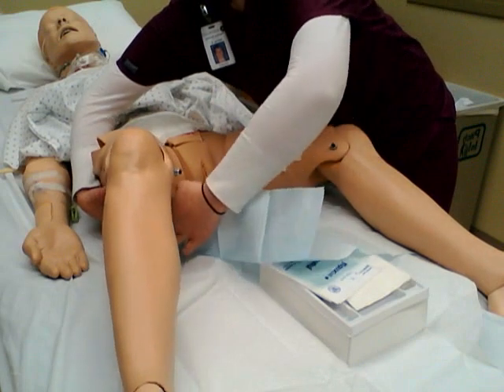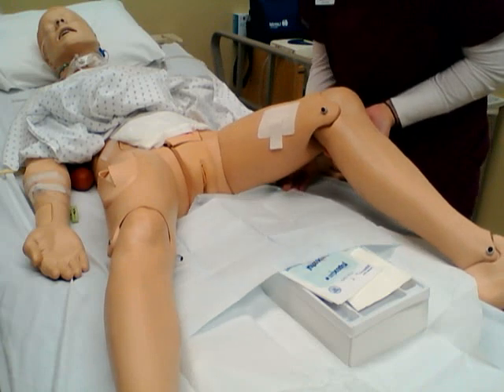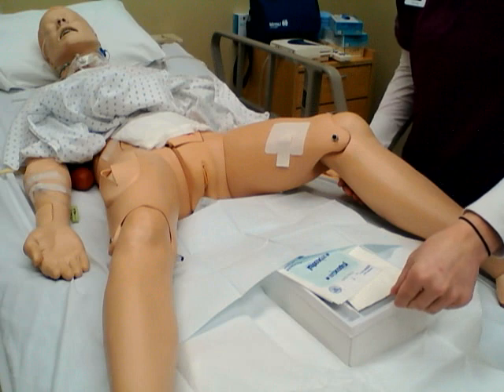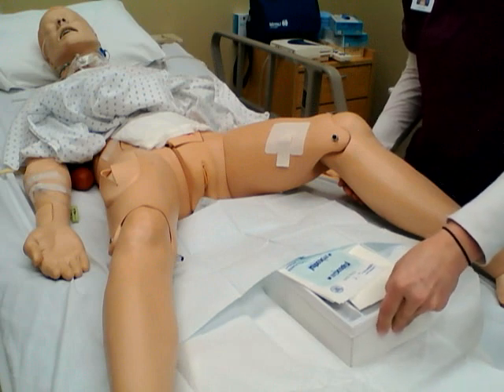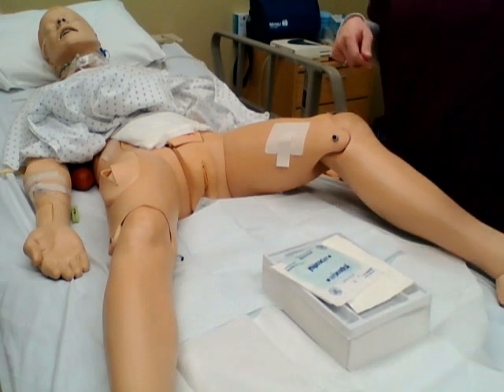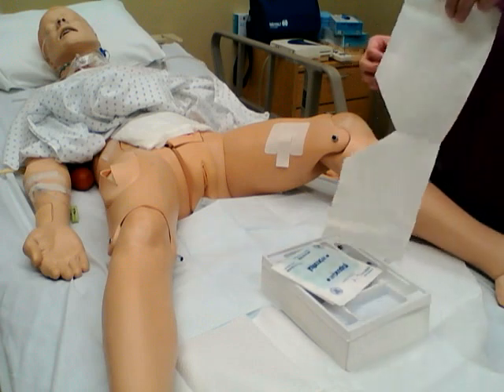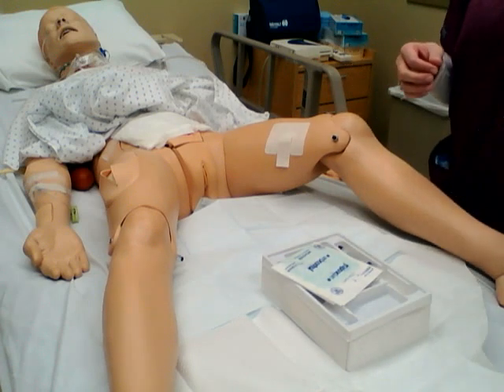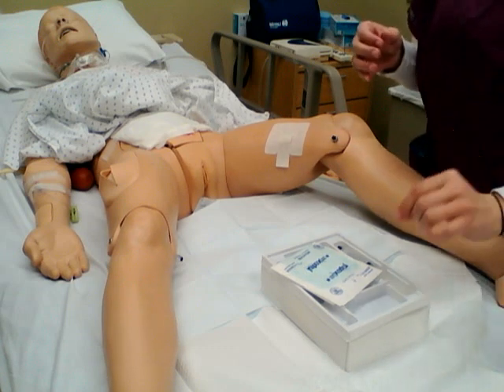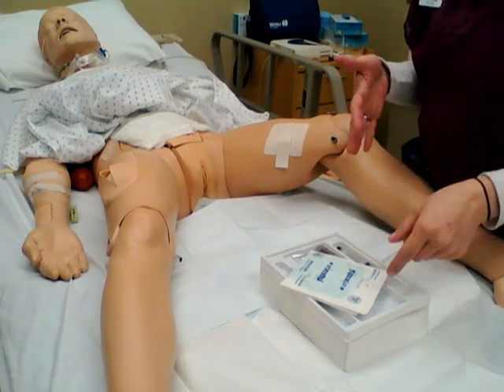Just grabbing the shiny side. And this would still be sterile because this end has not touched anything. Going to remove this. This would be to cover the patient. That's mostly for males, but in this case we will not be using it. Okay, now, since the patient is ready and prepped, I'm going to don my sterile gloves.